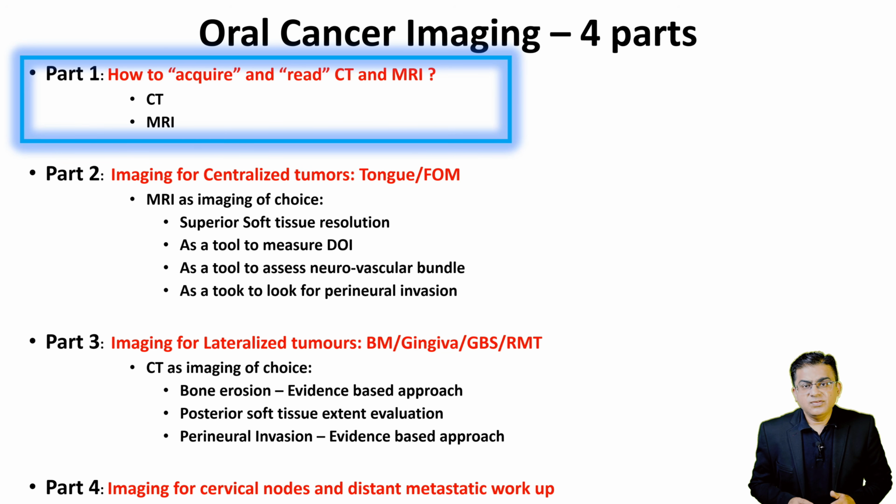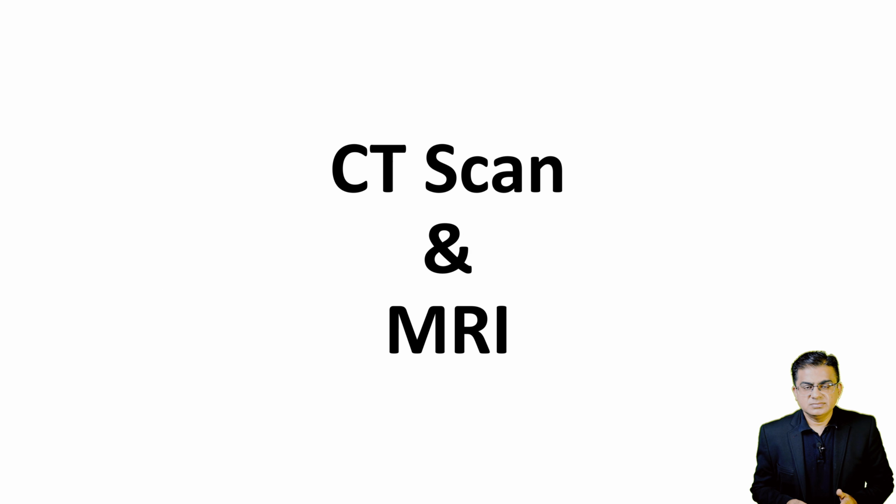Let us start with the first part. Foundation of imaging and acquisition protocols, CT and MRI. Before we dive deep into the topic, I want to spend some time teaching you some basics and fundamentals of ordering a CT scan and MRI.